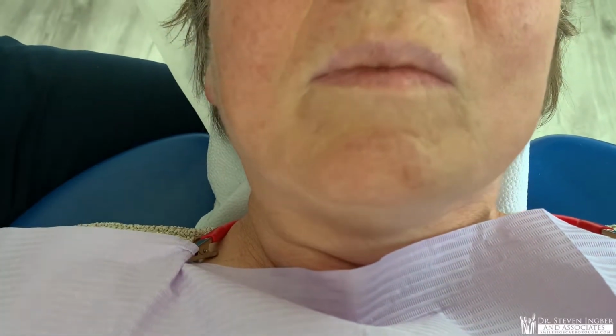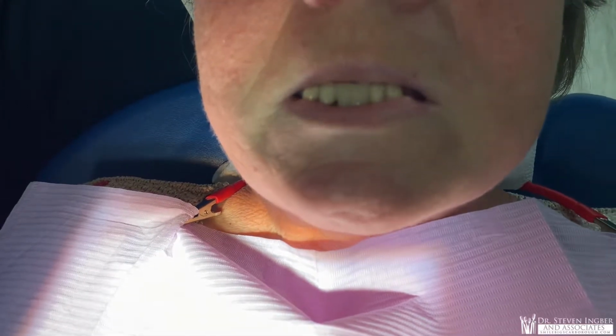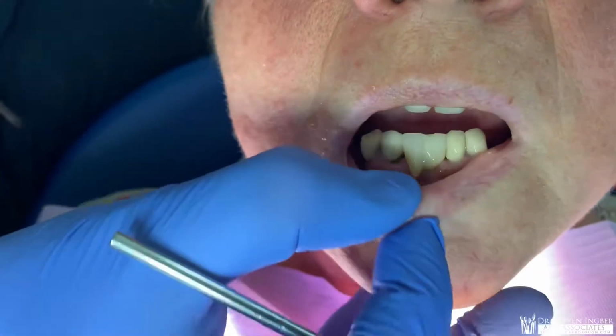So give us the biggest smile, Elizabeth. You won the 649 finally. Give it. Come on, push it out. Wow. Now what do we see here? Well, look in the middle. Look at the lightest teeth that we have there. And the lightest teeth that we have there are one implant that's in her mouth in the bottom there.